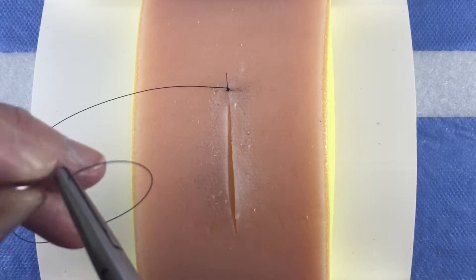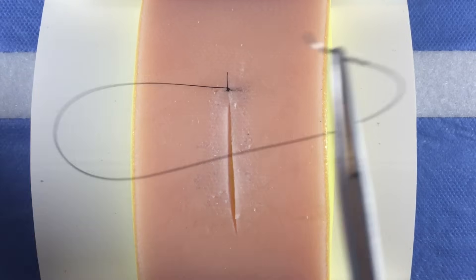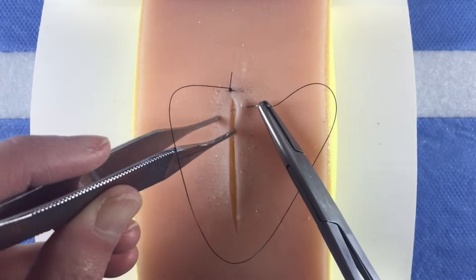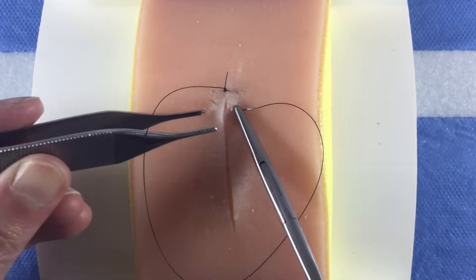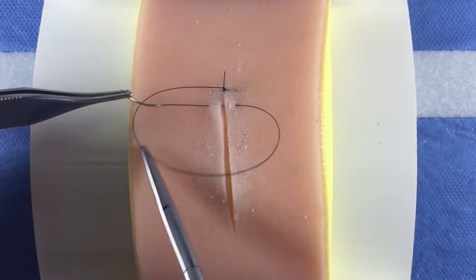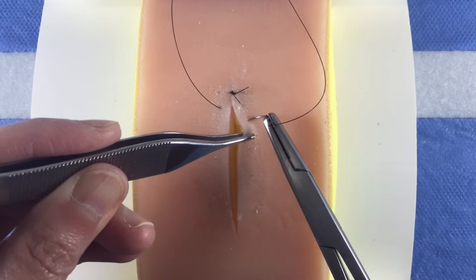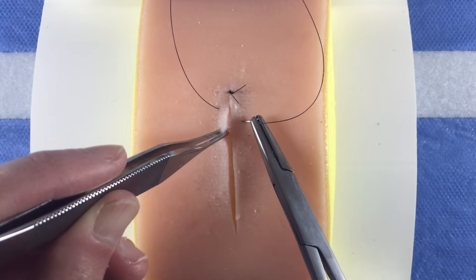Load your needle and drive the needle horizontally across the wound, taking care to maintain the same distance from the wound edge on each side and also the same depth on each side. Taking bites at different depths will cause the closure to be uneven, with one side of the wound higher than the other.